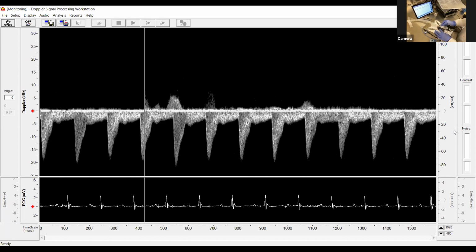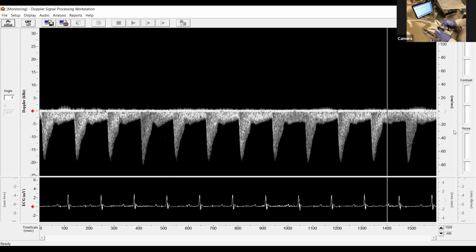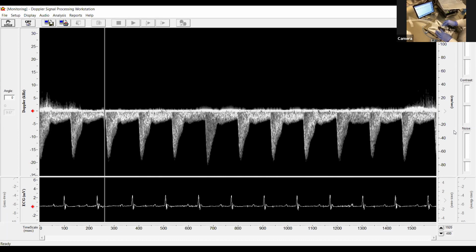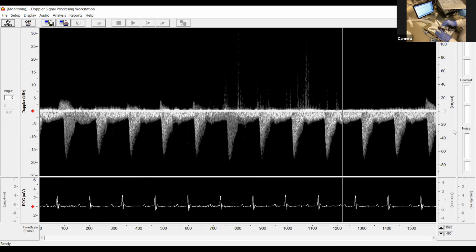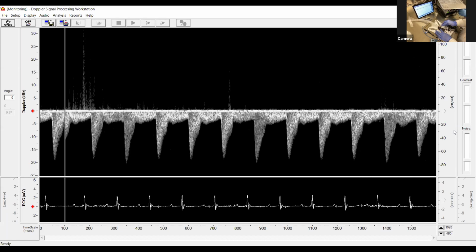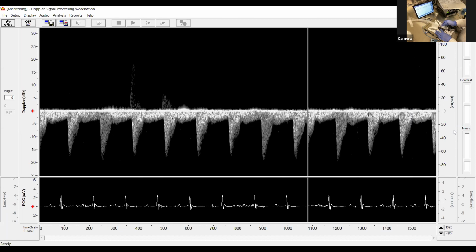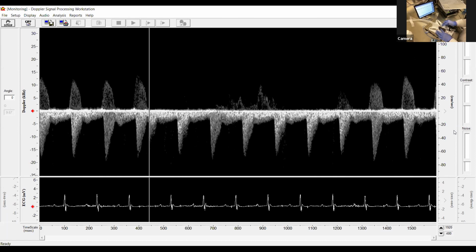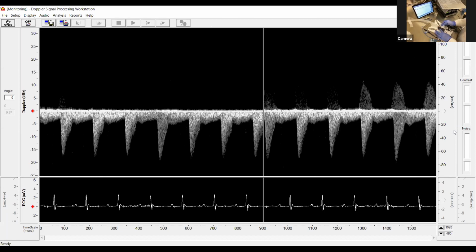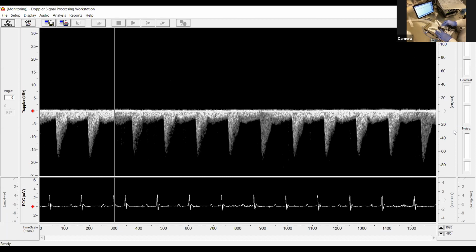So we'll just get a nice strong signal on both. Okay, so it's at 6 now. So I'm just adjusting the depth from this probe because we have the remote plugged into the other channel at this point.